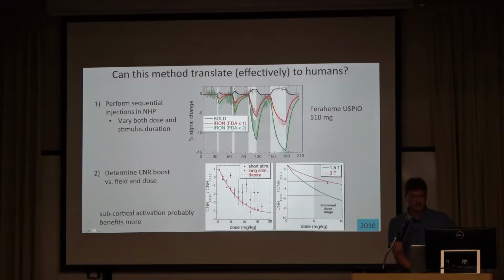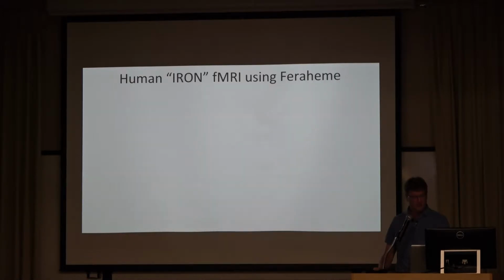At 3T, maybe you're talking about 2.5 or something like that. Still a big factor when you think that you only gain that back as the square root of time. Also, one thing we should point out is that you have this nice amplification in cortex. Once you get below that cortical surface, BOLD is even less favorable. So if you're talking about subcortical activation, all of these should be increased by another 60%, maybe less than a factor of 2, but not something over that order, right?